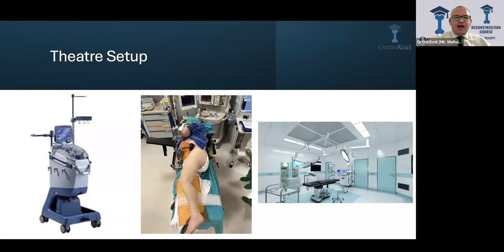Positioning your patient, you have to do the positioning of the patient, never leave it for the trainee. It's not about being against the trainee, but the one who will operate has to position the patient, because you will build all the next steps based on how you positioned your patient.